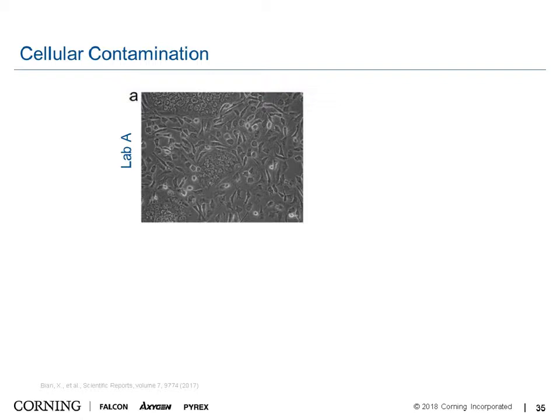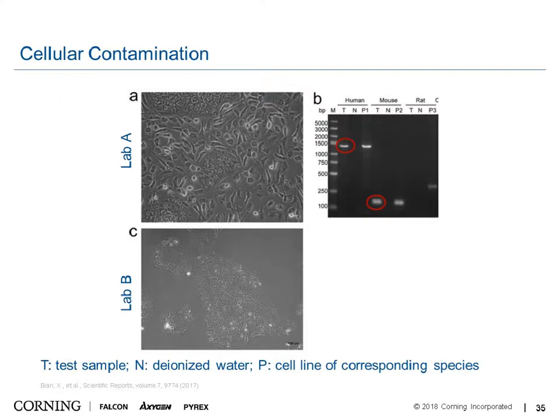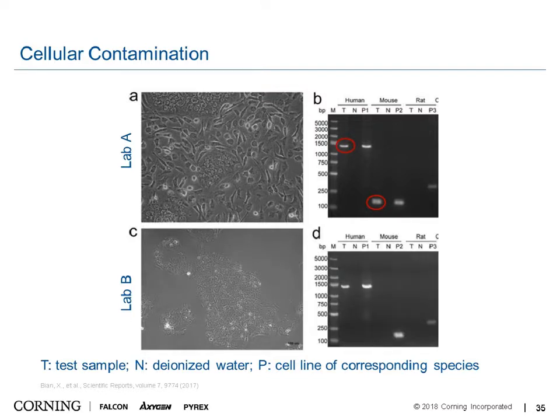The lab ran a PCR to check what's actually going on. T is the test sample — that's genomic DNA of the cells — along with a negative control and a species control. The results show those cells contain human cells but also mouse cells, meaning there is a clear cross-species contamination. Normally the cells should look more round in shape, and when you run the PCR you should see only human cells and no mouse cells.